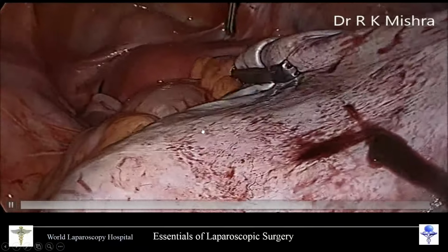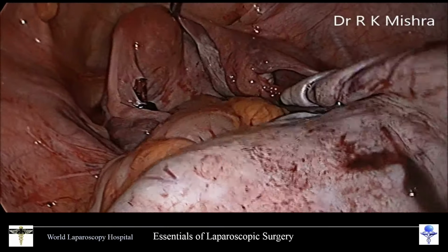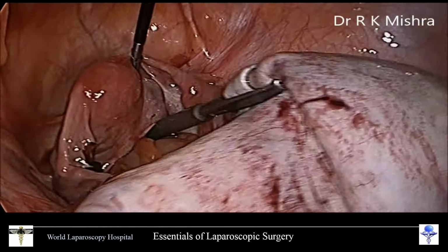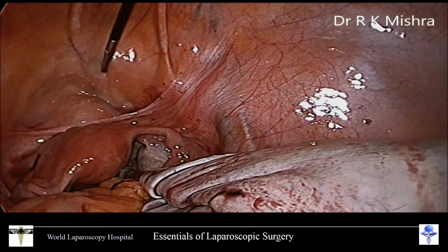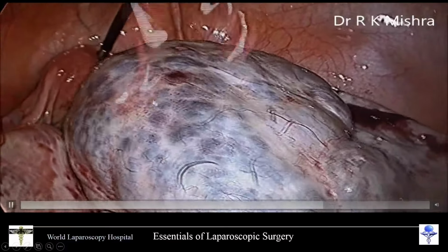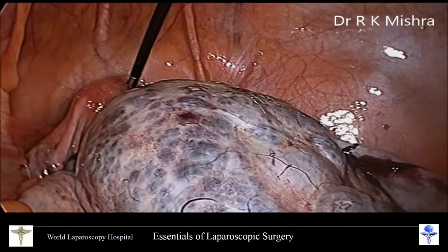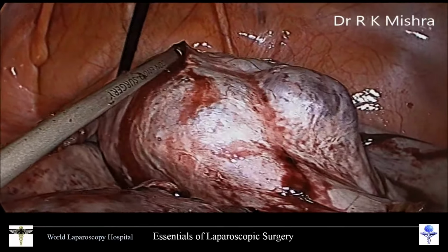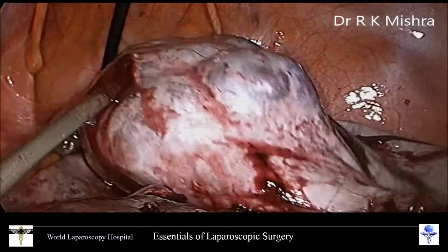You have to be careful, because omentum, small bowel or sigmoid colon should not be pulled together, because in huge cysts it is possible that the bowel or omentum can be pulled together. So, that is why one grasper will keep the bowel away, and one grasper is lifting the uterus, and slowly it will be bisected. Bisection has the advantage that if any uncut pocket is there, that also will drain the fluid.